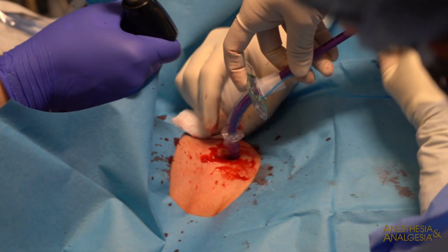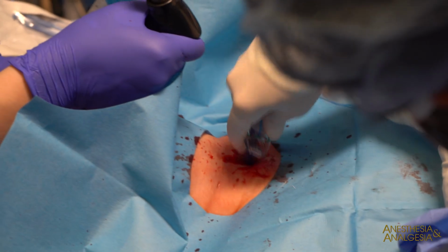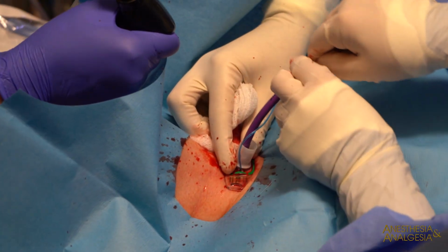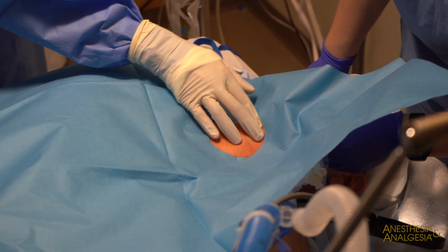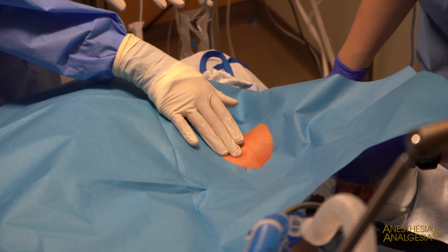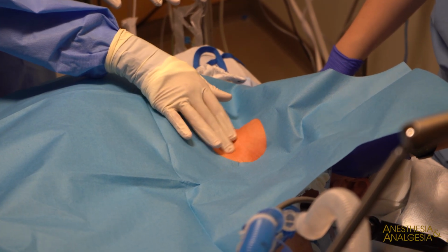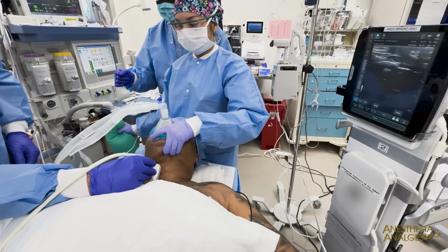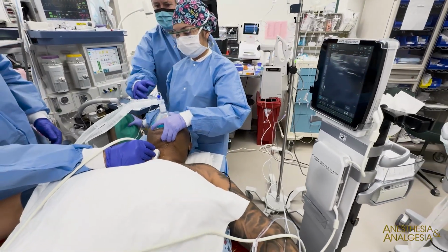Emergency front-of-neck access, including cricothyroidotomy and tracheotomy, is a rare but life-saving procedure to oxygenate and ventilate patients with a failed airway. This can be challenging to perform using landmark techniques and digital palpation, especially in patients with indistinguishable neck anatomy. Airway ultrasound can be used to guide these procedures with enhanced accuracy, higher success rates, and lower complication rates.